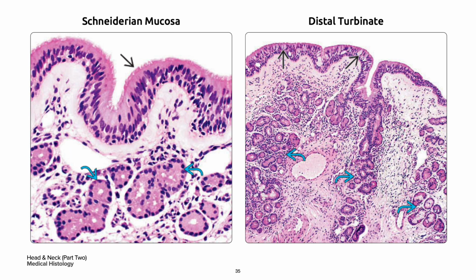On your left, similar to the rest of the respiratory region, the turbinates are lined by your ciliated pseudostratified columnar epithelium in a single black arrow, with your scattered mucous or goblet cells. Varying numbers of seromucous glands in a curved blue arrow are present in the lamina propria and drain directly to the surface via your small ducts.